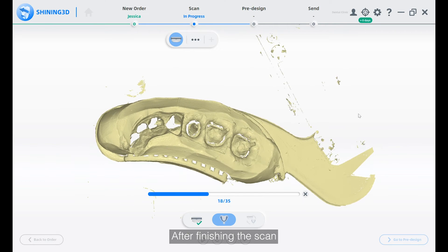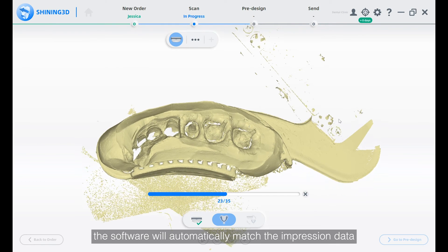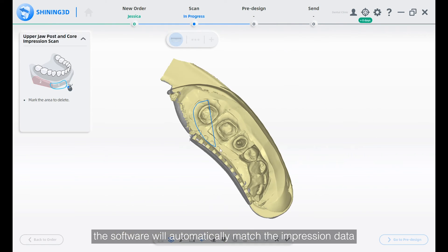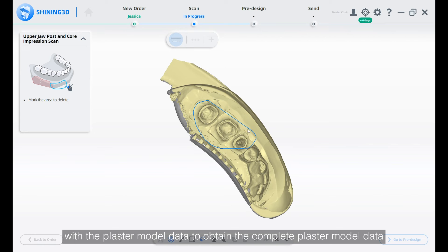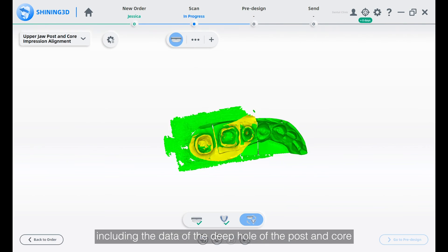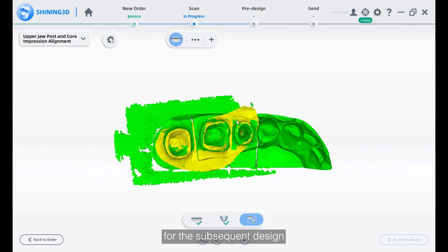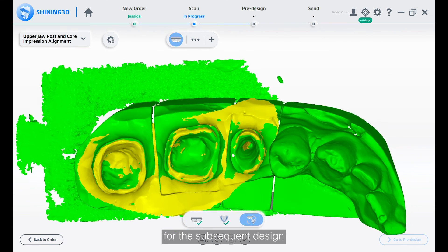After finishing the scan, the software will automatically match the impression data with the plaster model data to obtain the complete plaster model data, including the data of the deep hole of the post and core for the subsequent design.